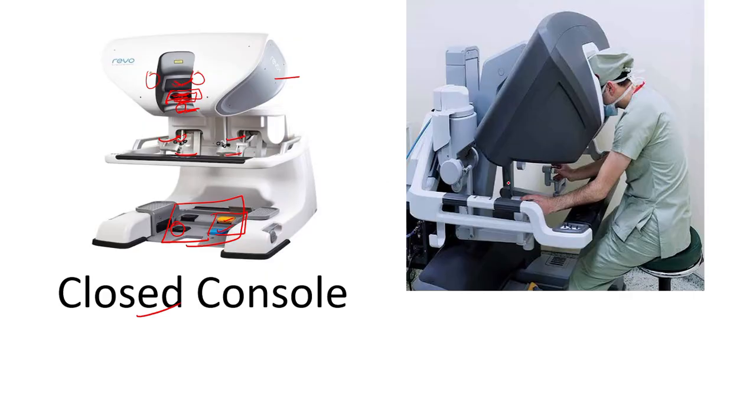If you see the second type, this one is from Robo Surgical and this one is from Intuitive. These are the ergonomic control buttons available in the surgeon console. In some companies they have made it digital, so these buttons are not there and may be available in their UI design. The surgeon puts their head into the headrest, their eyes are completely aligned to the optical viewer, and he can communicate with the team with the help of this mic and translate their hand movement with the hand controller.